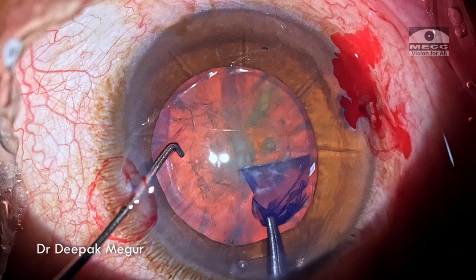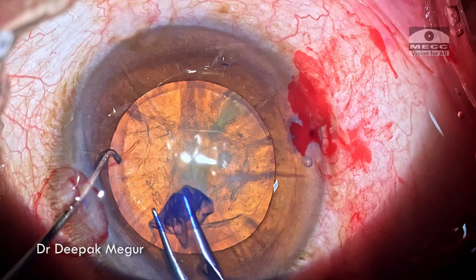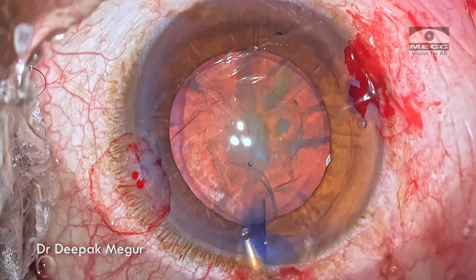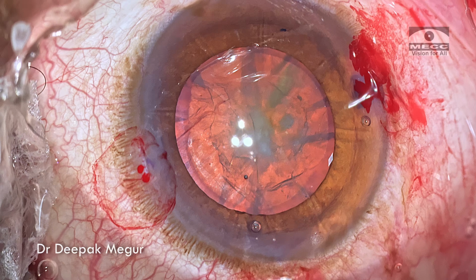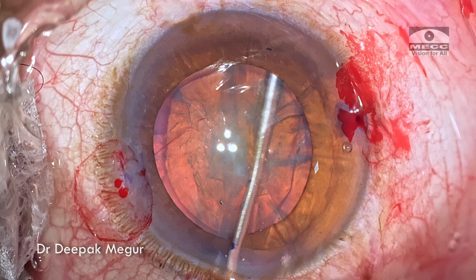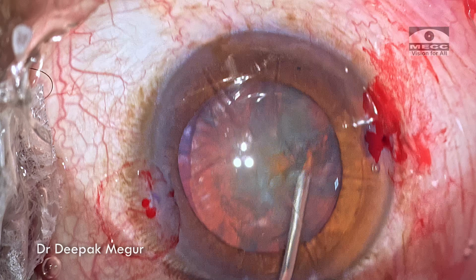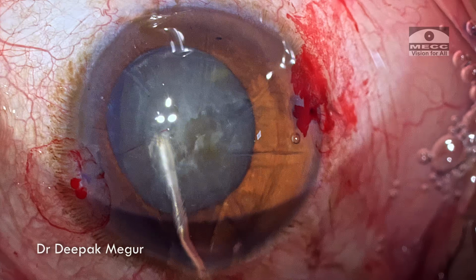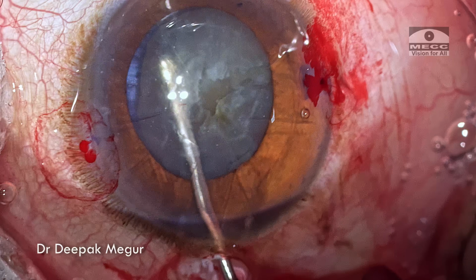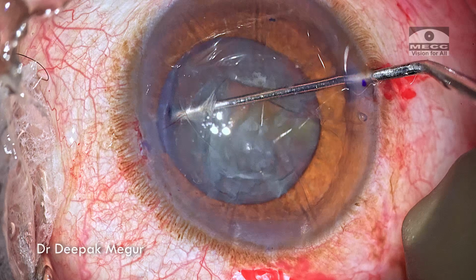So I'm planning to have a 5 mm Rhexis. An appropriately sized and centered Rhexis is created. Time to perform the hydrodissection. I'm going to decompress the anterior chamber by burping out a little bit of OVD before placing my cannula just under the anterior capsule, and using a small amount of fluid, cortical cleaving hydrodissection is performed. The nucleus is then decompressed from the other end. The nucleus rotation is confirmed.